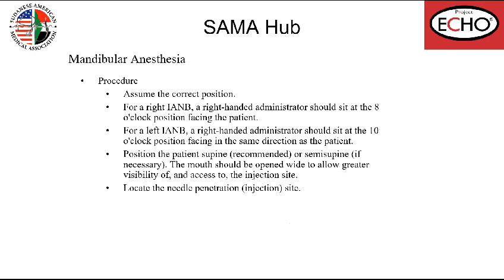The procedure, the correct position, of course: if you are giving to the right side, you should be in front of the patient. And if you are giving to the left side, you should be 10 to 11 o'clock behind the patient.